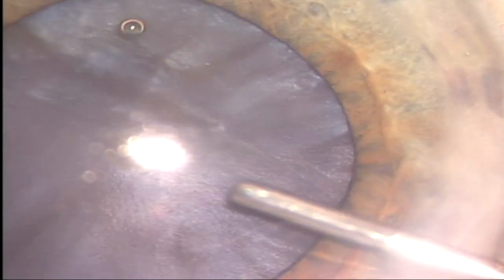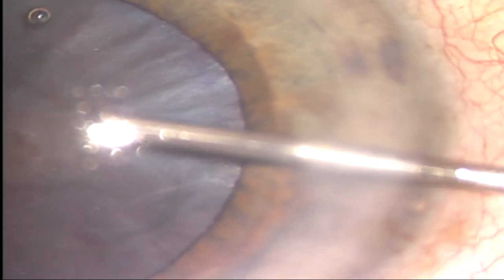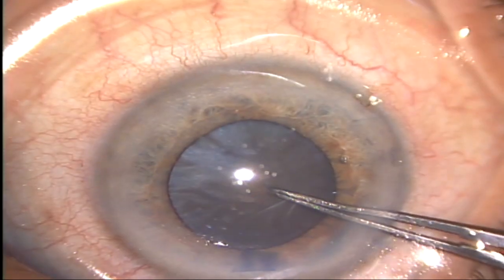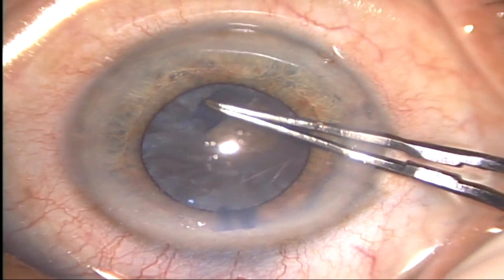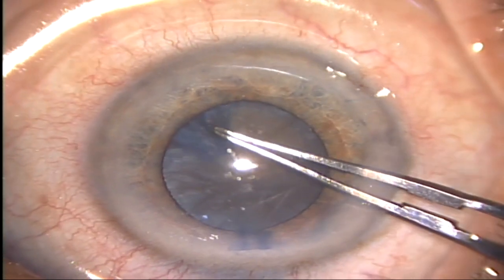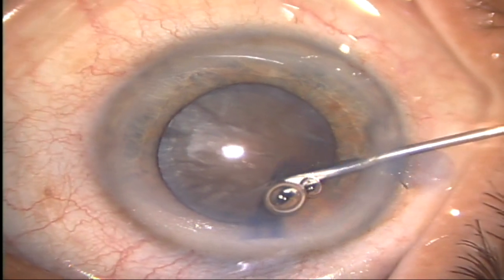Complete evacuation of intralenticular fluid, including the posterior compartment fluid, is achieved by tapping and pressing the anterior capsule posteriorly with the help of a cannula. Once the capsular bag decompression is complete, the anterior chamber is again filled with cohesive viscoelastic to re-pressurize and flatten the anterior capsule. Capsular rhexis is then initiated from the central hole and easily completed with rhexis forceps without the risk of peripheral extension of the capsular tear.